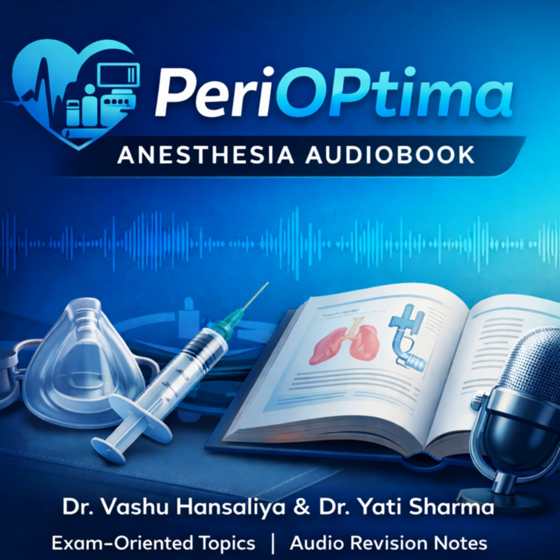4. ECMO. VA is for heart and lung support. VV is for lung support only. 5. ECMO physiology. Blood flow controls oxygenation. Sweep gas flow controls CO2 removal. 6. The biggest complications for ECMO are bleeding and, for VA ECMO, limb ischemia. And 7. Monitoring. Always use a right-hand SpO2 for peripheral VA ECMO to detect Harlequin syndrome.